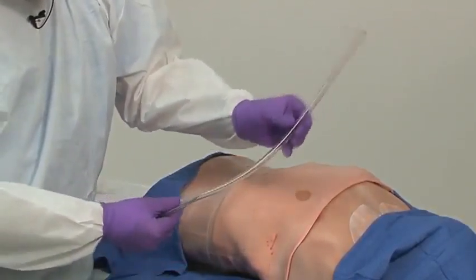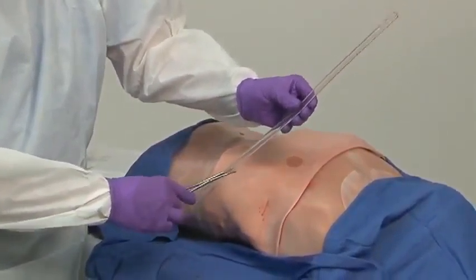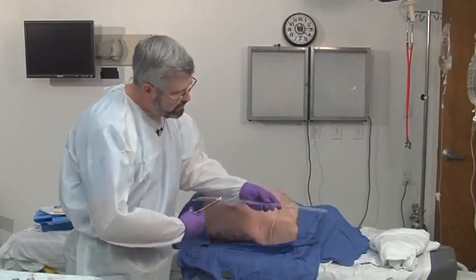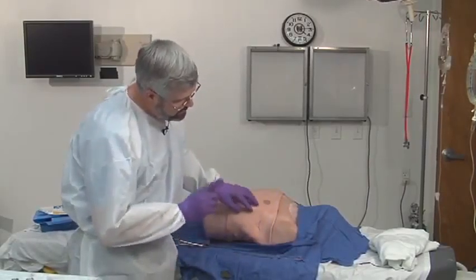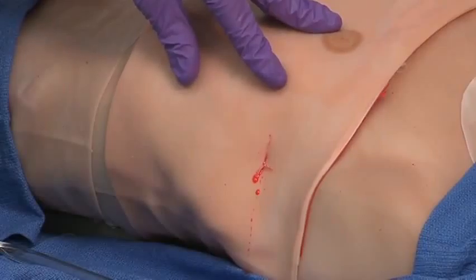The other little trick here is that you want to make sure, when you're putting this in for suspected blood, that you clamp the end of the chest tube, because if you stick this into the chest and there's blood in the chest, it's going to come out all over your shoes. So we've got our chest tube ready, we've got it clamped. Now we're going to go ahead and put our finger back on the bone and feel it. We now can feel the bone underneath our finger here. We're going to take another large clamp.